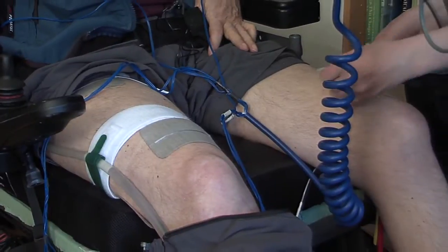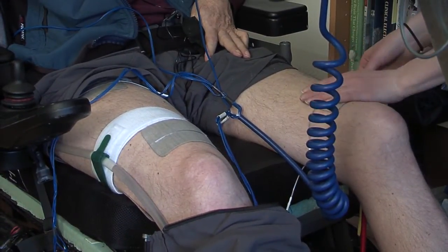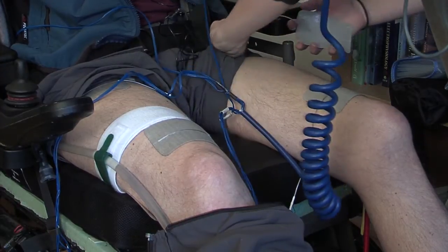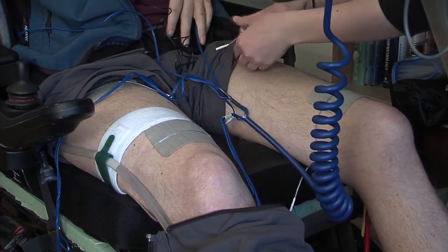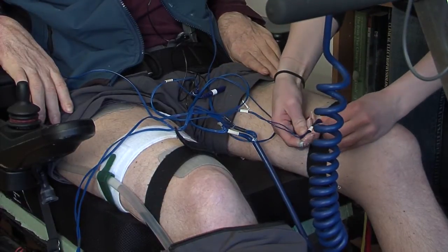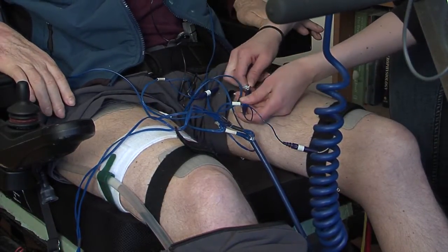I don't have any finger function, so I need help putting the pads on my legs and getting set up. Once I've started to ride, I can be somewhat independent. I can reach the screen and, as it's a touch screen, I can start and stop the exercise by myself.